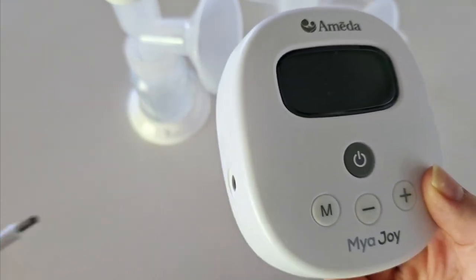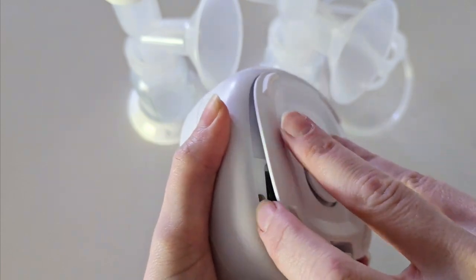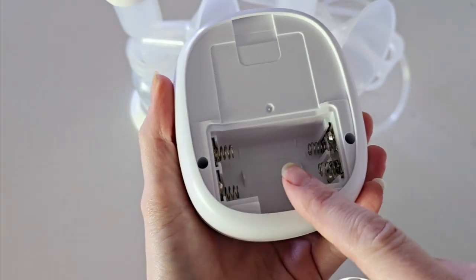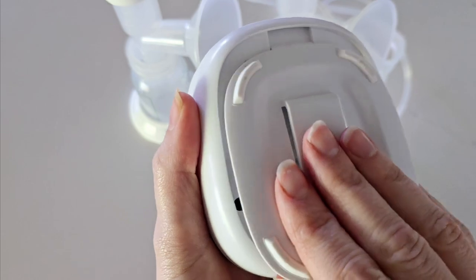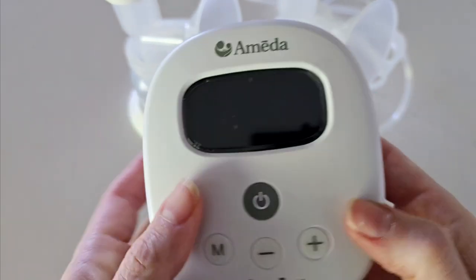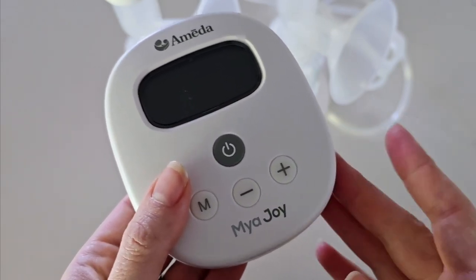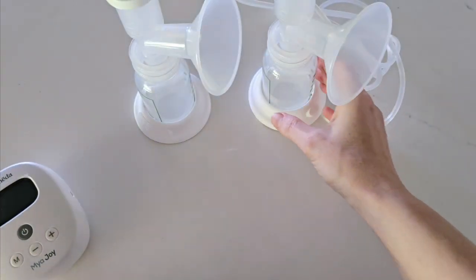This is powered via a plug-in charger, however you can also operate it portably via four double-A batteries. This is not a rechargeable unit, so if you are using batteries these will need to get replaced once they are drained.